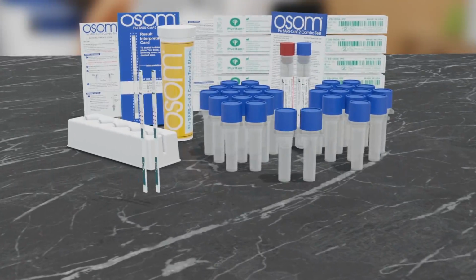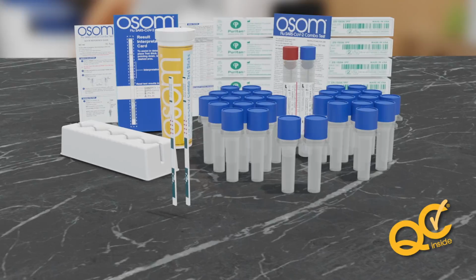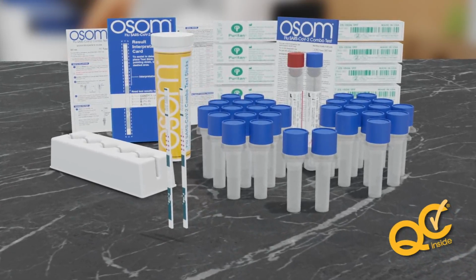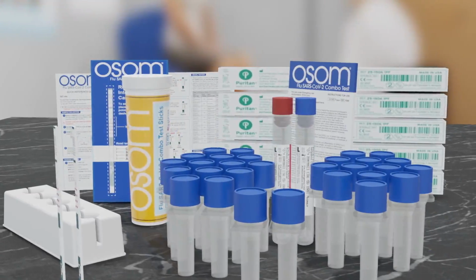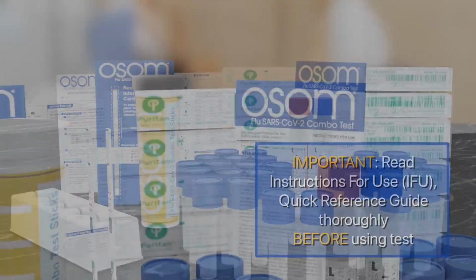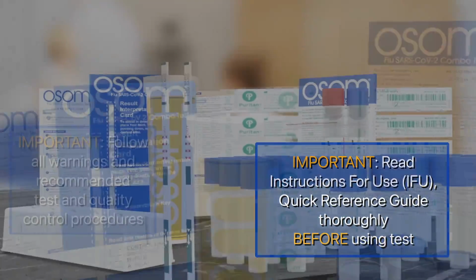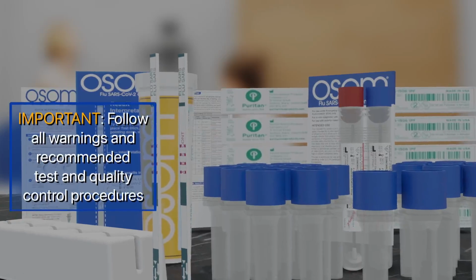2 extra test sticks and extraction buffer vials have been included in the kit for external quality control testing. Sekisui Diagnostics recommends that positive and negative external controls be run with each new lot, shipment received, and with each new untrained operator. Prior to running patient samples, please note the following precautions to assure accurate results. Read the instructions for use and quick reference guide thoroughly before using the OSOM flu SARS-CoV-2 combo test. Follow all warnings and recommended test and quality control procedures.